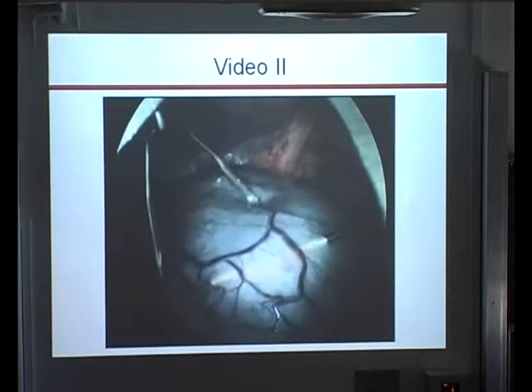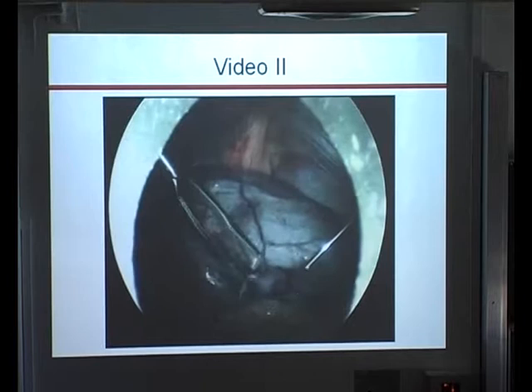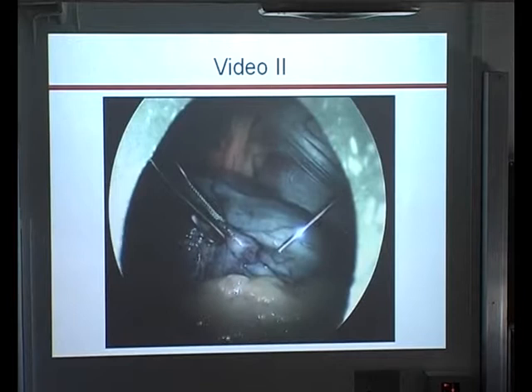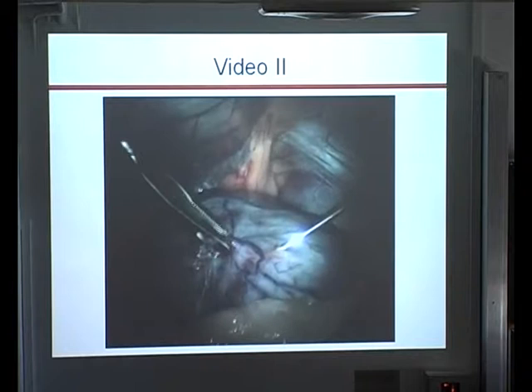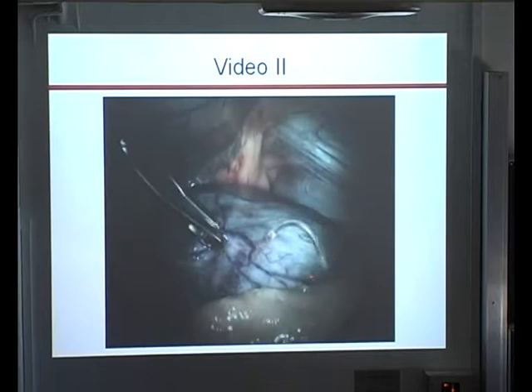That's what I meant. So it's just too full. So now, when you get hold of the bladder, then you can remove the first trocar. There will come a bit of urine out of this puncture site here, but you try then to insert the catheter at this point, and then you can just pull, very similar to the trocar. Just pull it near to the wall of the urinary bladder, and then it will stop.